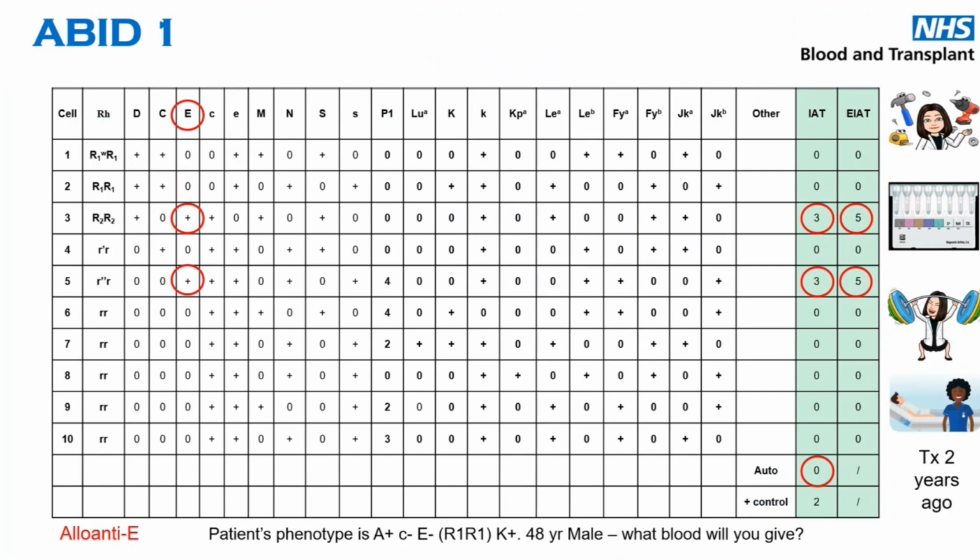So we're just going to move on to our first antibody ID. For this one, within RCI, we use the same format for our R1, R1s and little r, they're always 1 to 10. So 1's always CW pos, R1, R1, 2, etc. So whenever you have certain antibodies, you can look at the pattern. For this one, I haven't gone through and done all the little lines to save time. So I have just matched the pattern up. I'm hoping it'll make sense when I do it.